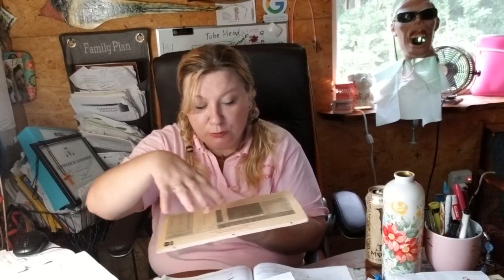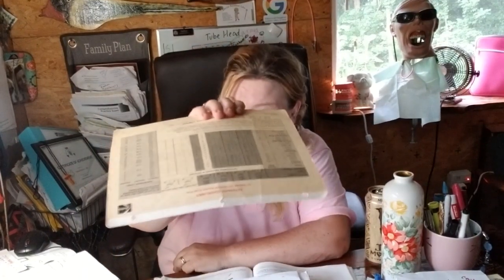Flip them over once you've exposed them, or put them in a cup so you can transport them to the darkroom. That way, you remember where you left off, because there could be an emergency in another treatment room, and they say, hey, Teresa, I need you. Well, when I get back, I can't remember which one I was doing, let alone the patient is sitting in a chair waiting, listening, ear hustling. And then you come back and, oh, I'm going to take this extra. Well, you already took that one. You know, because you did it the same way every time, okay? Remember that.